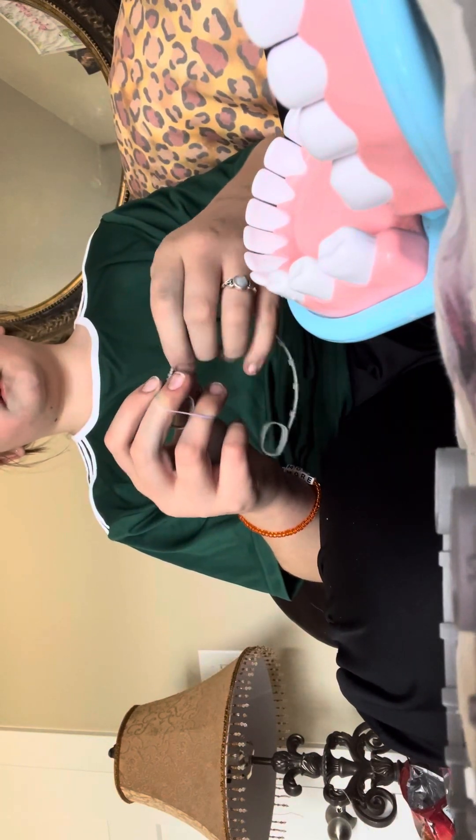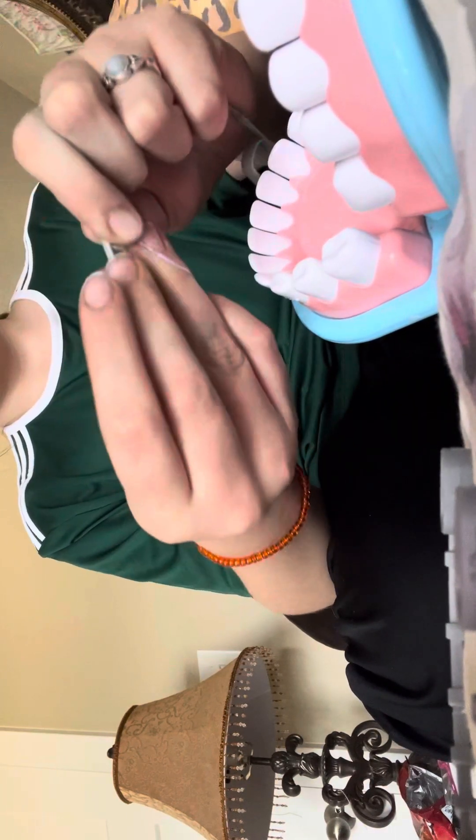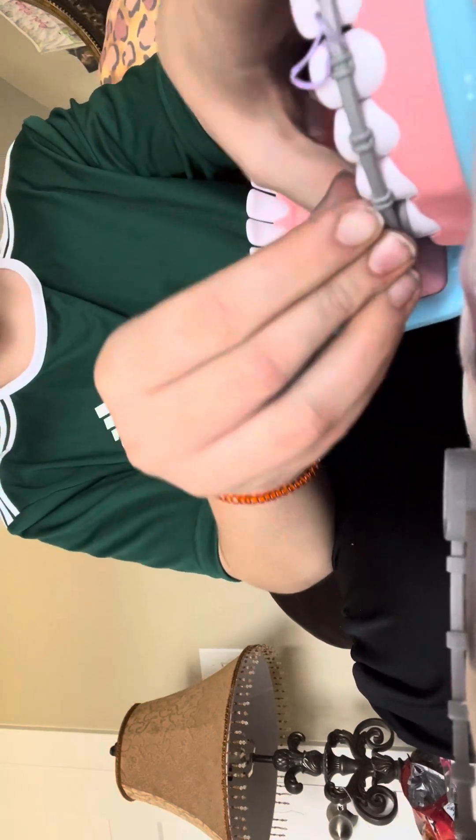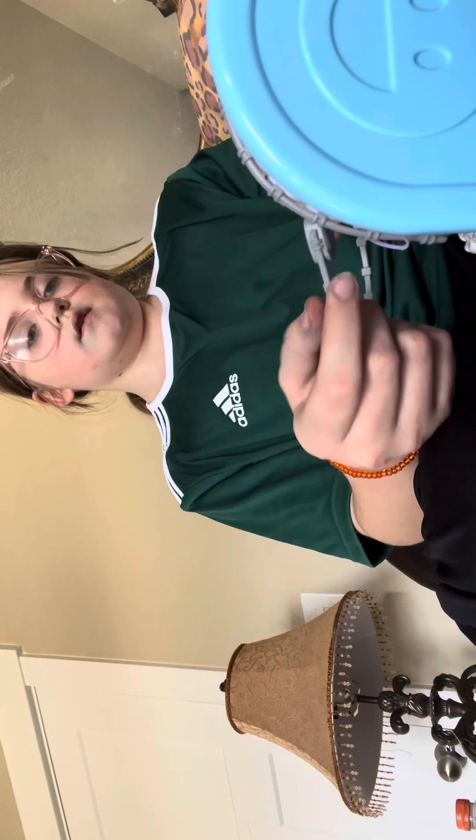First we're going to start off with the top, and I know where I need to put it. I'm going to have it right there and put it down. I'm going to take the elastic band and put it really close to what I need to put it on. Then I'll put the other braces on. Let's see if I can get the elastic in. I can't go too far, but I also can't go way too far or else it might snap off.